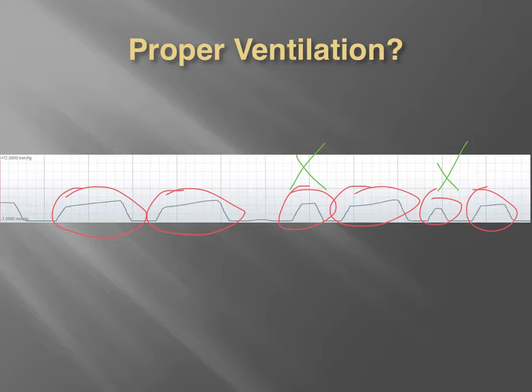So what we ended up having is a respiratory rate, the average was probably 25 to 32 a minute. Okay, way too much. What ended up happening with this waveform is the waveform kept on getting smaller and smaller. So the CO2 was actually moved down to around 20 millimeters of mercury.